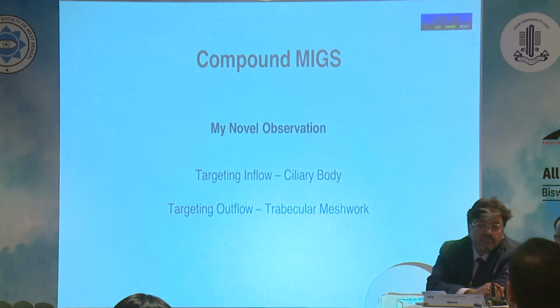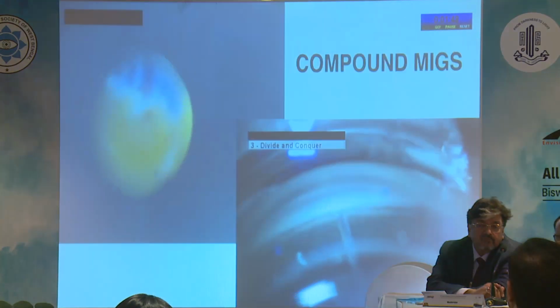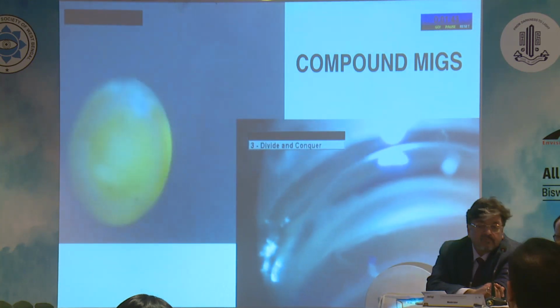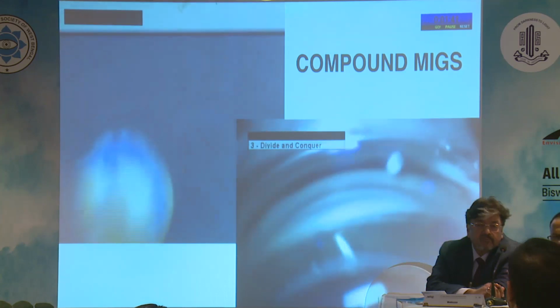Compound MIGS. It is a new novel technique of handling both inflow and outflow pathways, namely the ciliary process and trabecular meshwork, by ECP and BANG technique for adequate control over IOP.